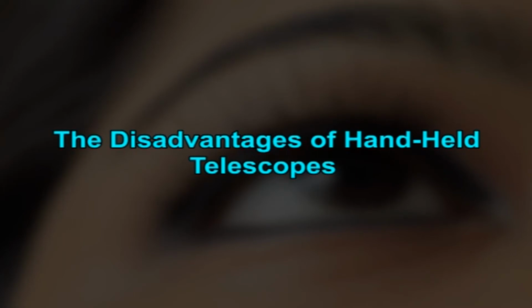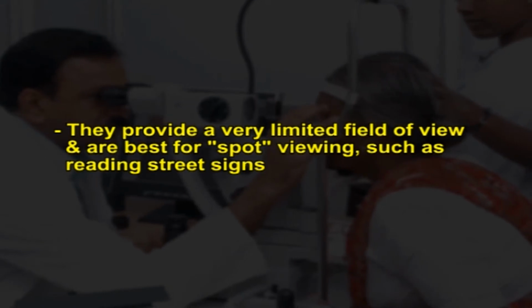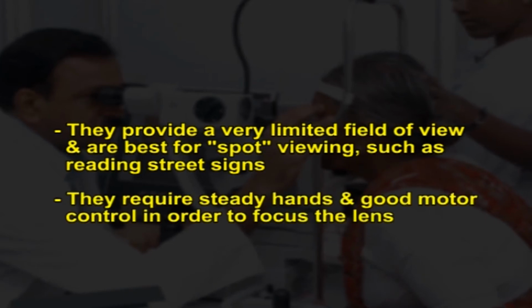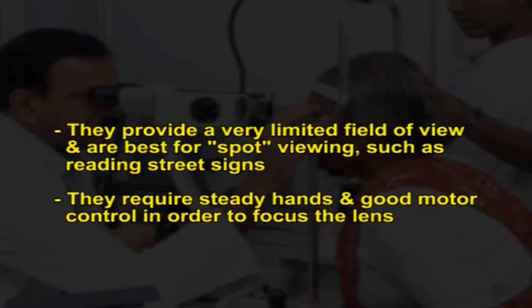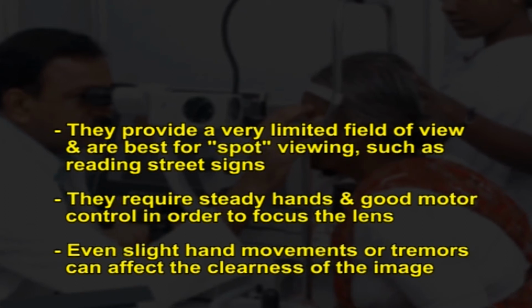Some of the disadvantages of handheld telescopes are they provide a very limited field of view and are best for spotting viewing such as reading street names. They require steady hands and good motor control in order to focus the lens. Even slight hand movements or tremors can affect the clearness of the image.